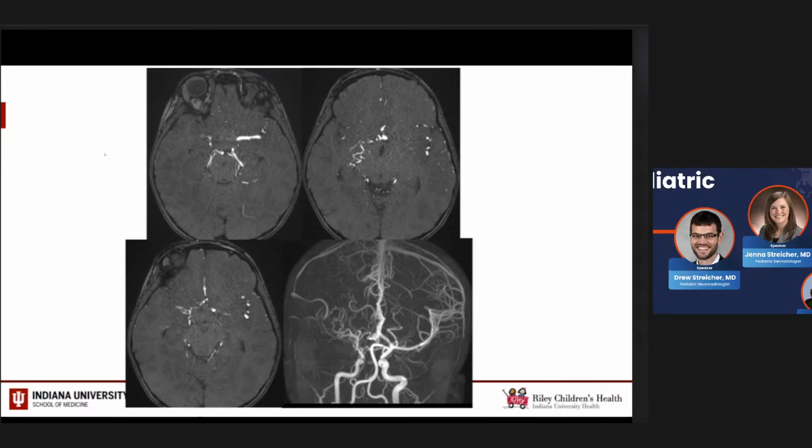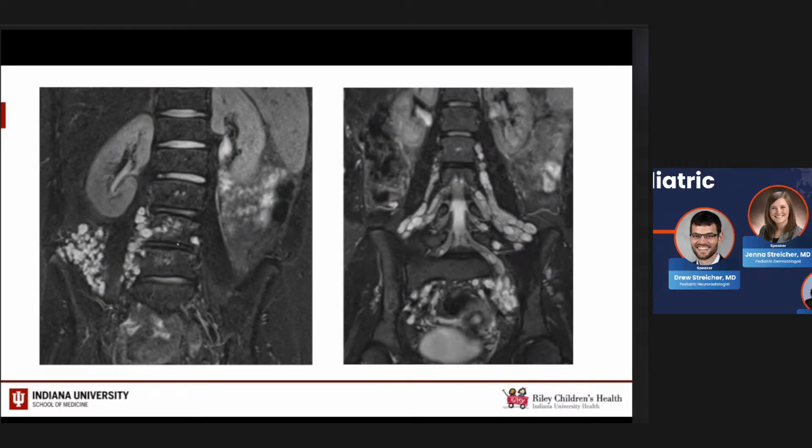All right, more plexiform neurofibromas in the spine. So they can be quite extensive as well. So image on the left here, we've got, again, those target-type lesions, rounded foci of T2 signal in the right paraspinal region associated with these exiting nerve roots, and then in the right iliacus muscle. Another patient on the right image, bilateral involvement along the lumbosacral plexus.